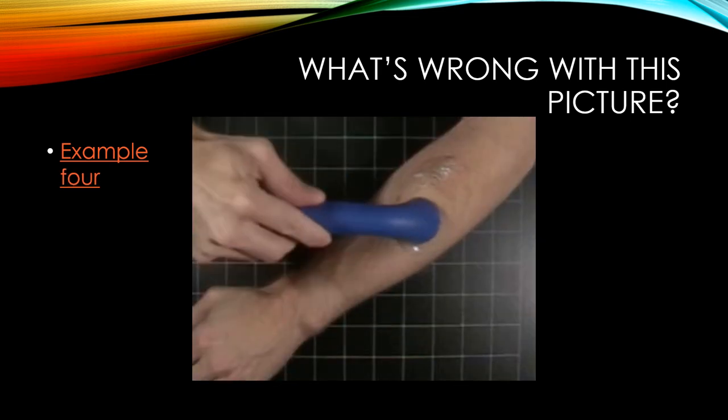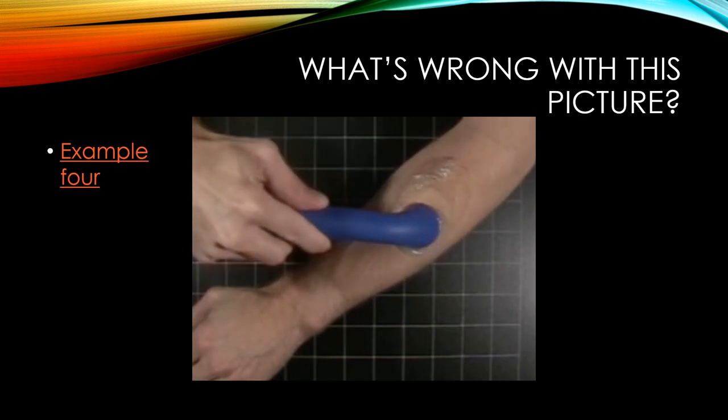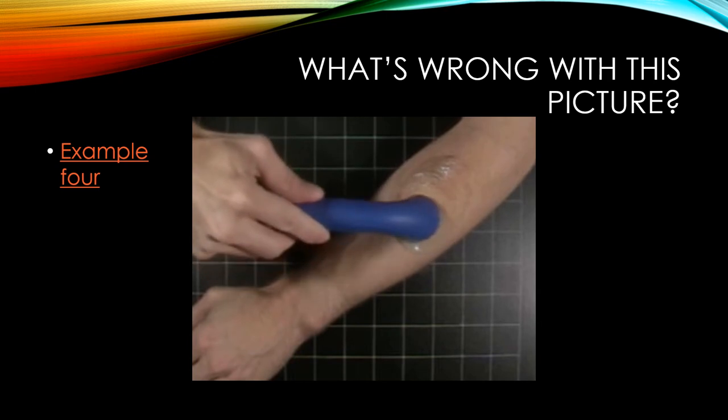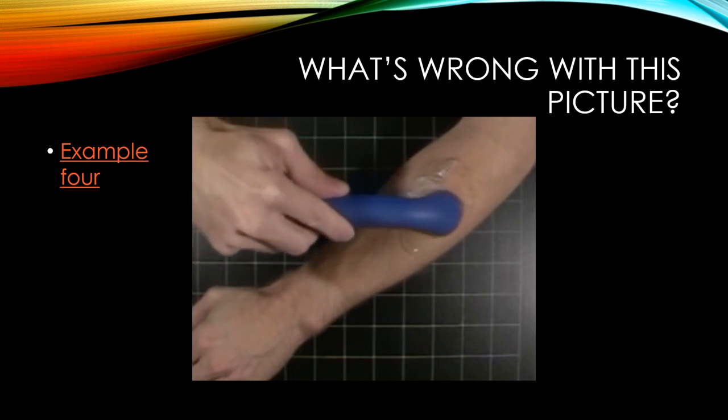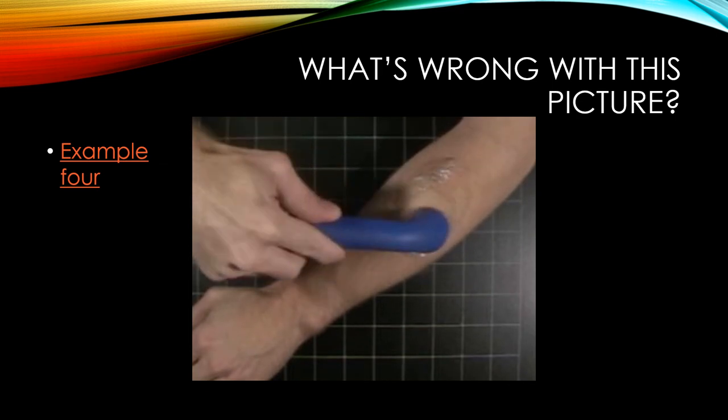A fourth example demonstrates significant tilting and rocking of the sound head. This means the collimated ultrasound beam isn't staying on the target tissue, and the tilting causes reflection, preventing ultrasound from penetrating the tissues effectively. The coverage area was also too big in that example.